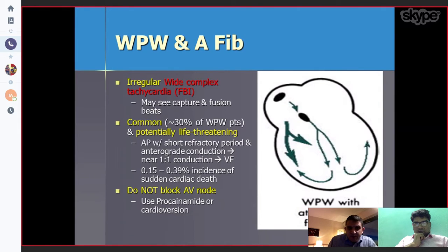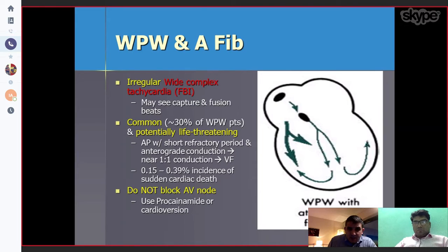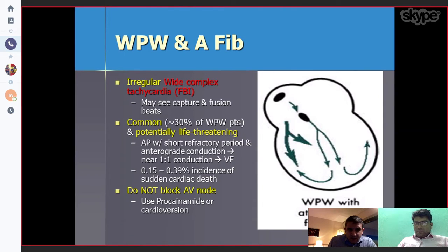WPW with atrial fibrillation produces an irregular wide complex tachycardia, also called FBI — fast, broad, irregular. It is commonly seen and potentially life-threatening. It can conduct one-to-one, which can degenerate into ventricular fibrillation. In this case, do not give AV-blocking medication. Use procainamide or cardioversion.